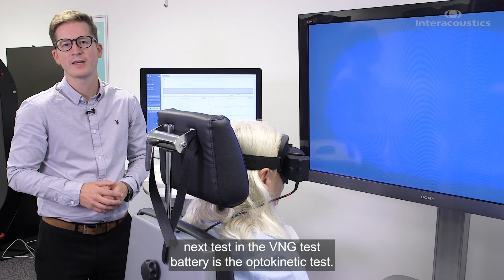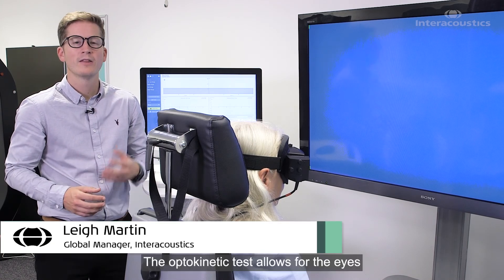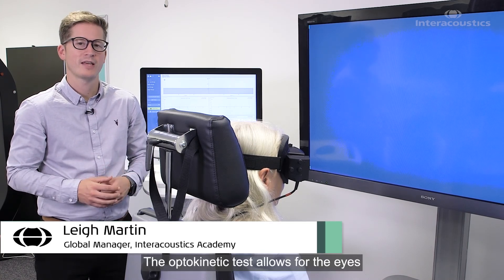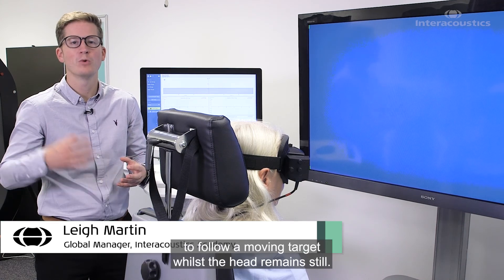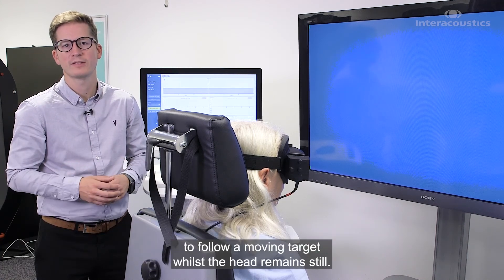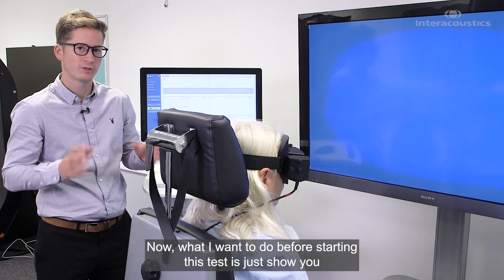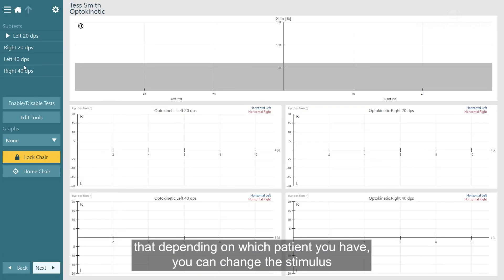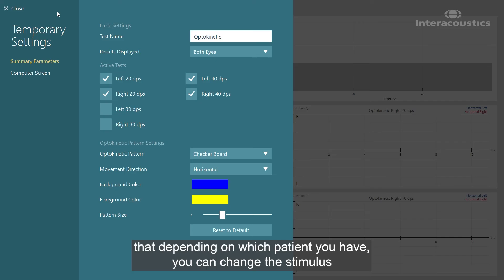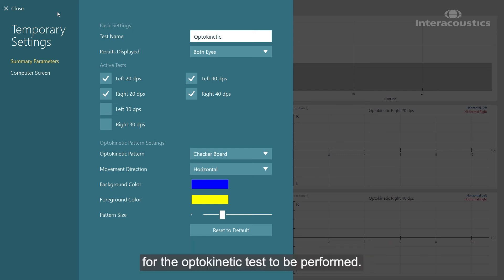The next test in the VNG test battery is the optokinetic test. The optokinetic test allows the eyes to follow a moving target whilst the head remains still. Before starting, I want to show you that depending on which patient you have, you can change the stimulus for the optokinetic test.